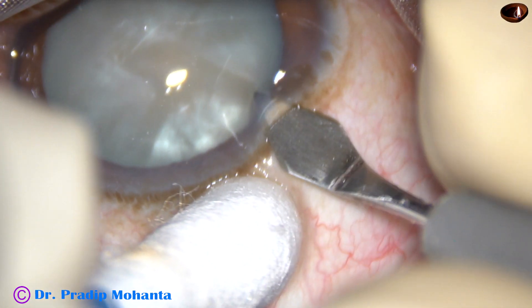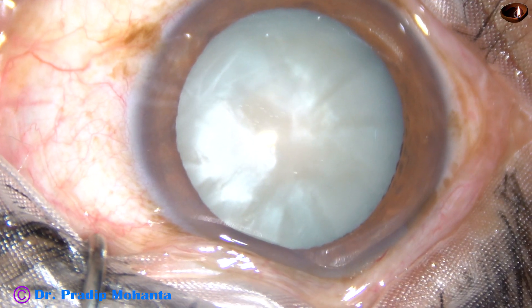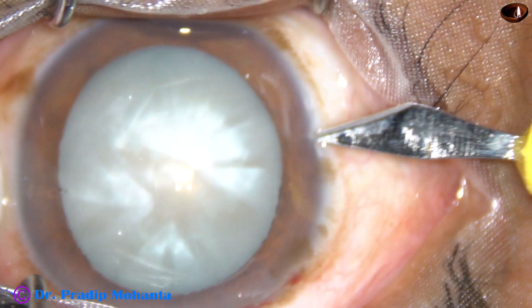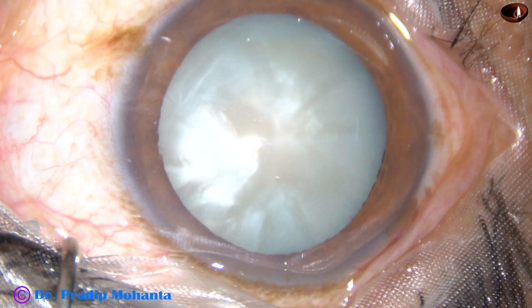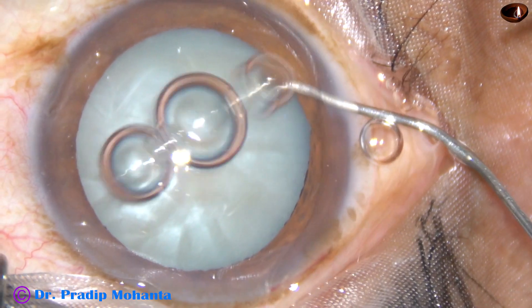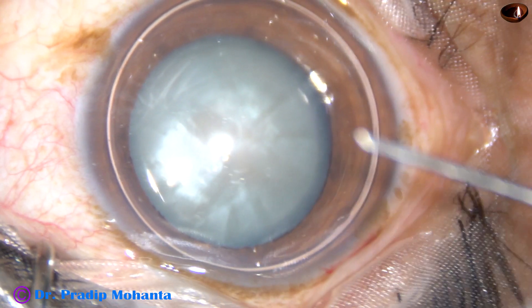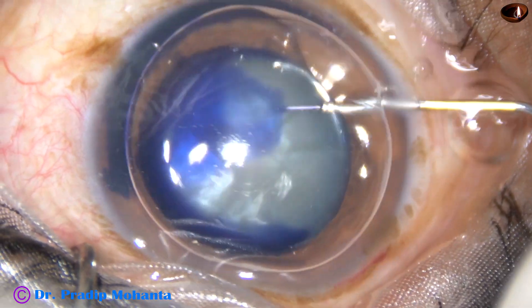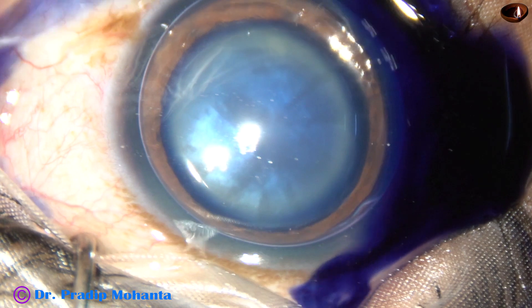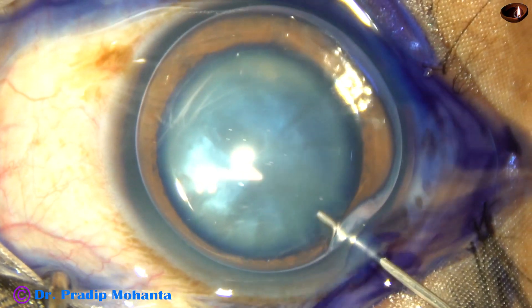This is the main incision on the posterior aspect of the limbus. And now, this is a side port on the right side of the main incision. An air bubble is injected now. Beneath this air bubble, trypan blue dye is being injected to stain the anterior capsule. And now, this is a bit of adrenaline.